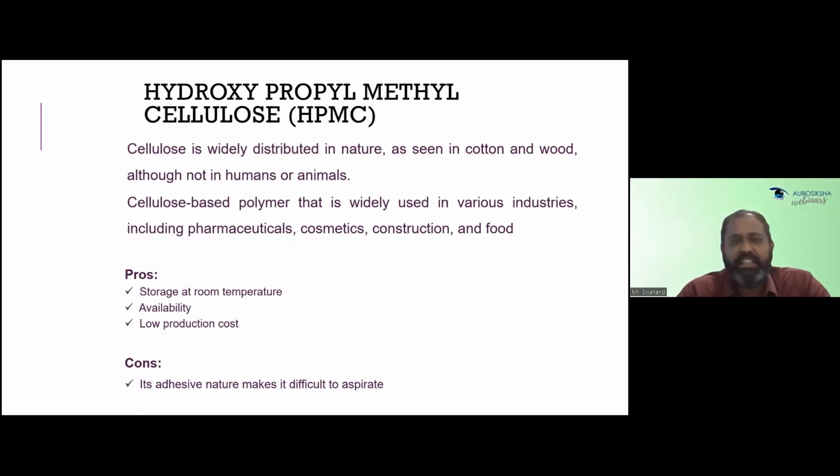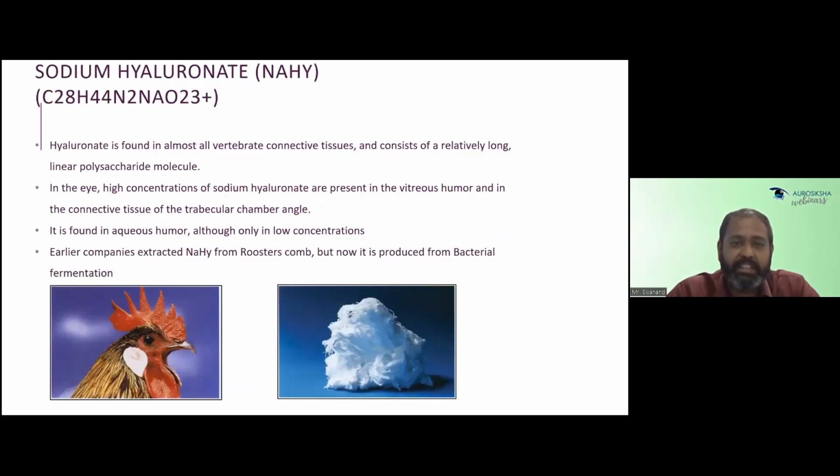The difficulty is that once you place it, these OVDs have to be removed. After the end of the surgery, they cannot be left like the intraocular lenses, which we leave inside the eye. These viscoelastics have to be completely removed from the eye. Otherwise, it will lead to an increase in the intraocular pressure, a rise of the IOP after the surgery.